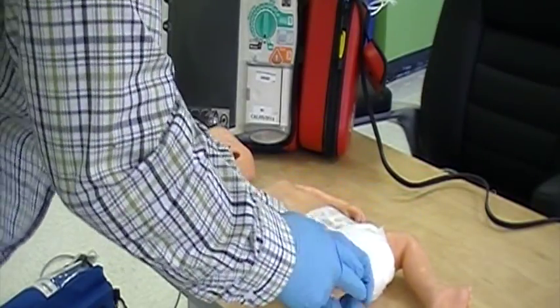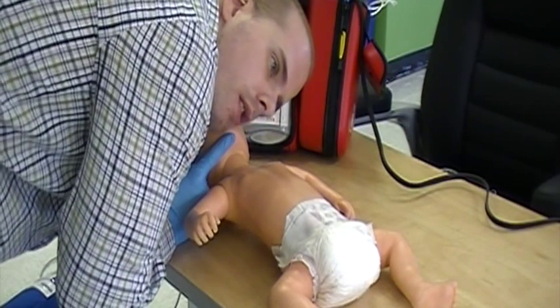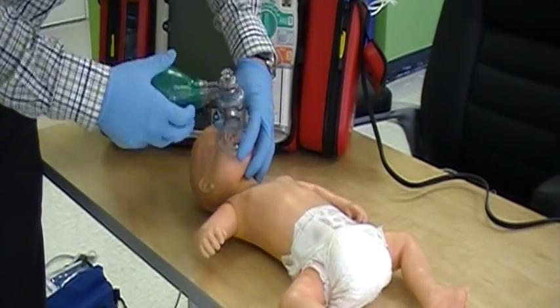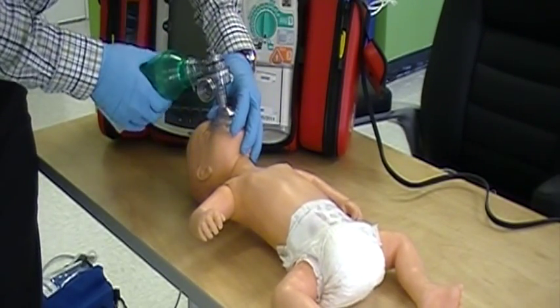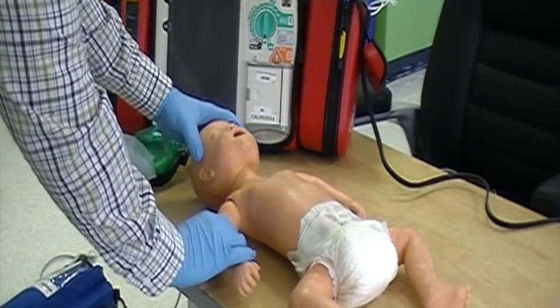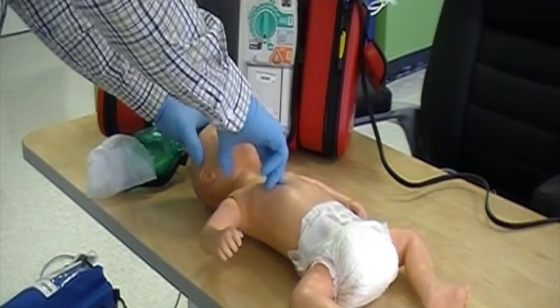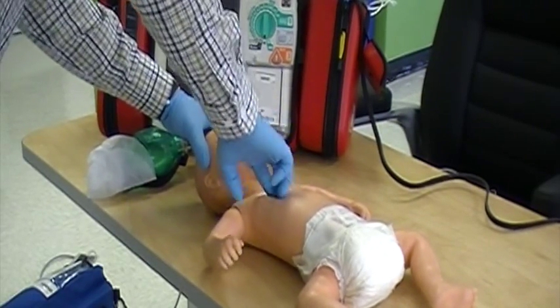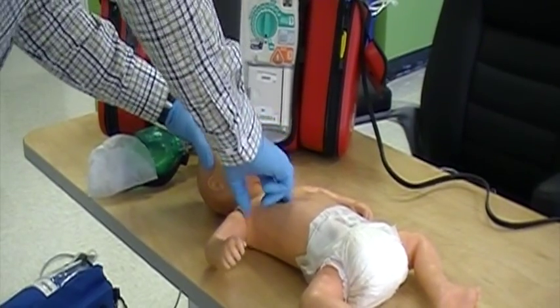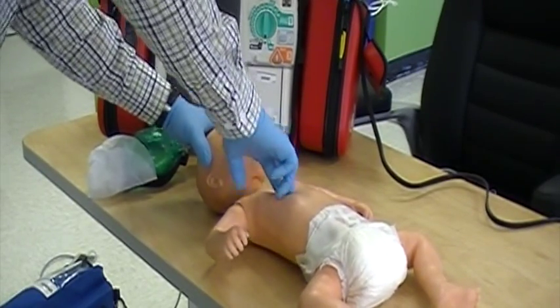Establish a level of consciousness. Open the airway using a head tilt chin lift and check for breathing. If breathing is absent, attempt ventilations with a bag valve mask. Assess pulse. If pulse is absent, begin CPR. Aim for a rate of over 100 per minute with a ratio of 30 to 2.